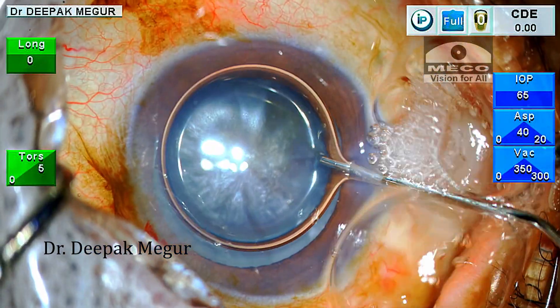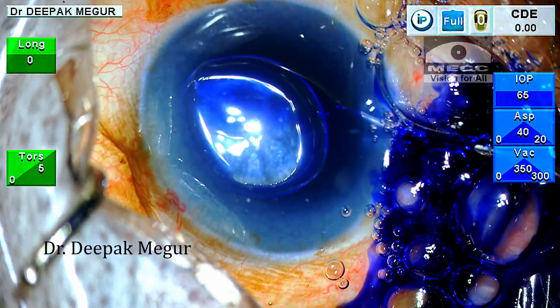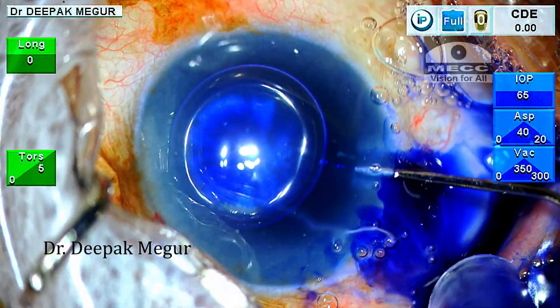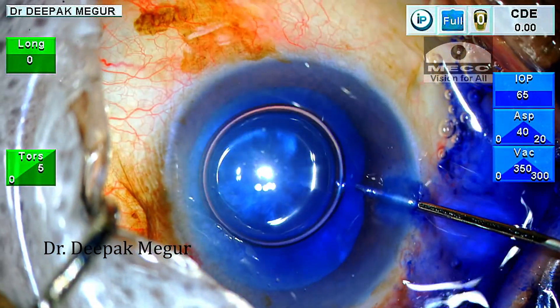At the slit lamp, this cataract did look like a swollen intumescent lens but the underlying lens was obscured by the swollen cortex. So typically in all intumescent lenses, my plan is always to perform a two-stage rhexis.